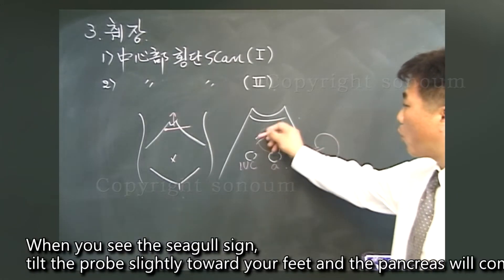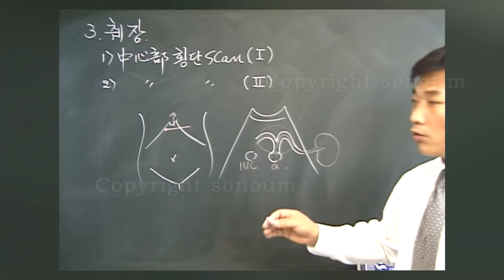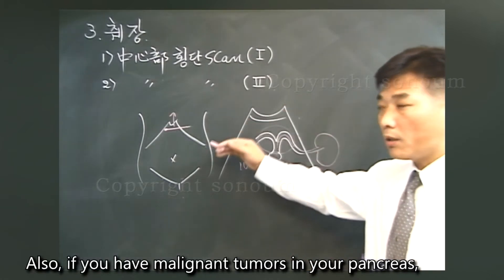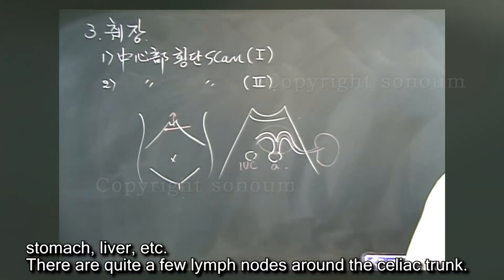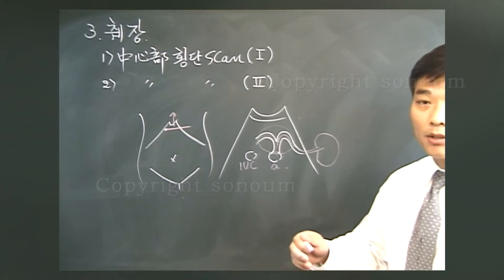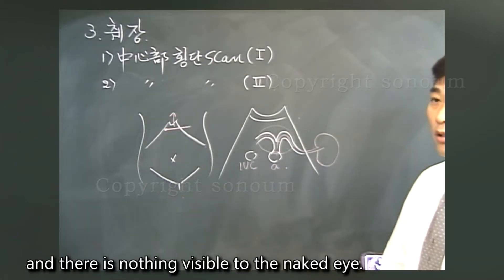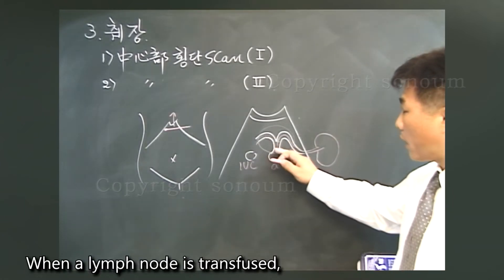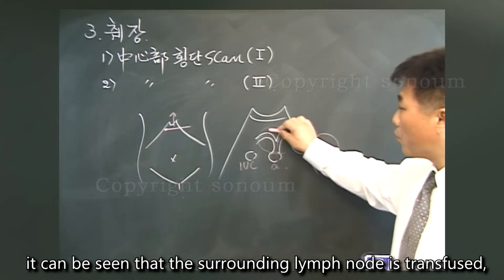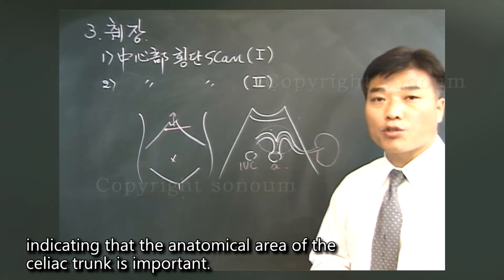When you see the seagull sign, tilt the probe slightly toward your feet and the pancreas will come out. Also, if you have malignant tumors in the pancreas, stomach, or liver, there are quite a few lymph nodes around the celiac trunk. In the normal state, there is mainly fat and nothing visible to the naked eye. When a lymph node is enlarged, the surrounding lymph nodes can be seen, indicating that the anatomical area of the celiac trunk is important.